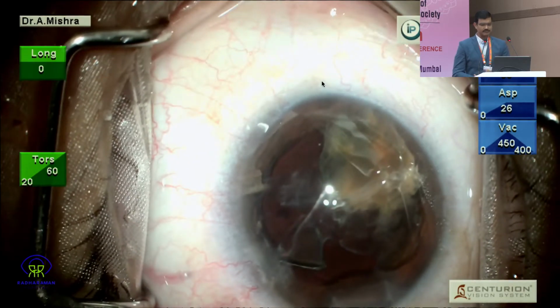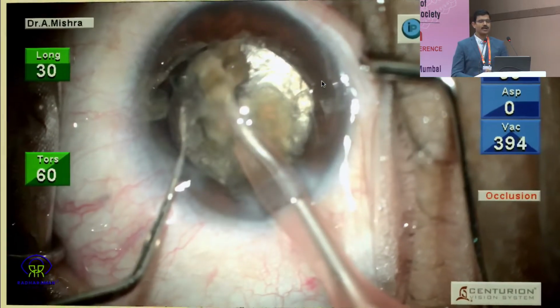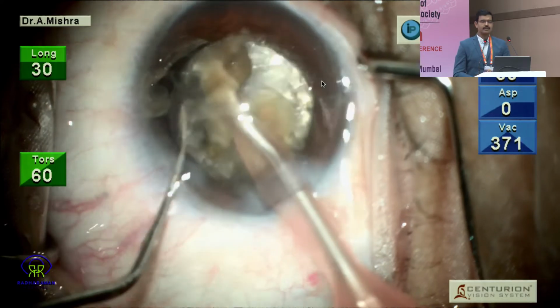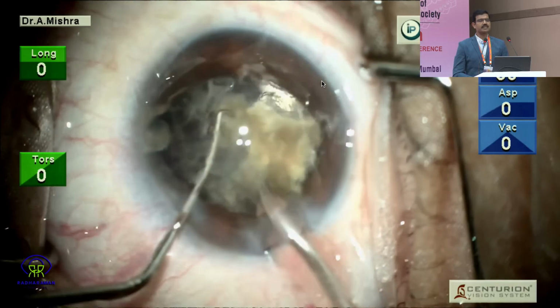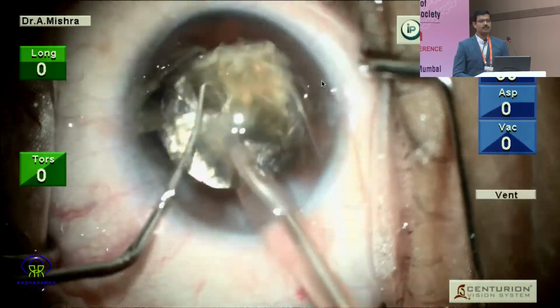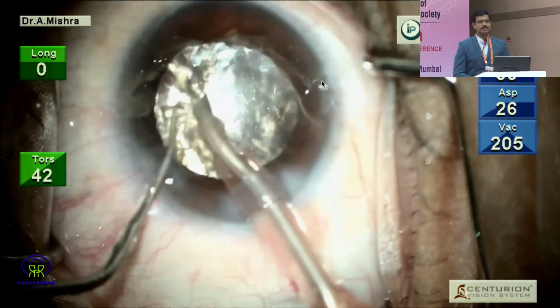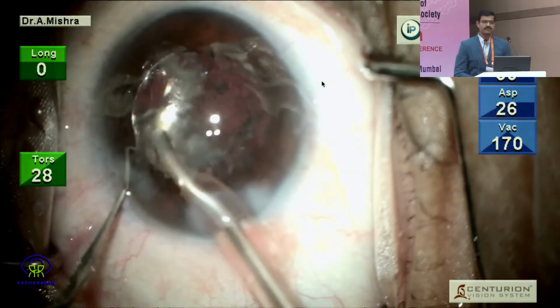Still, if you're not comfortable, you can use what is known as the IOL scaffold. It has saved many surgeons and many faces time and again. You can put in the IOL first, and then emulsify this hard piece of nucleus, all the while protecting the endothelium as many times as required. Just keep on replenishing it with dispersive viscoelastic.